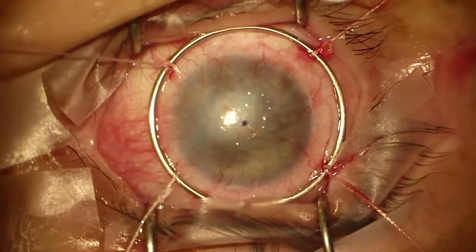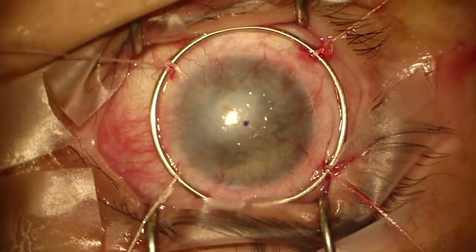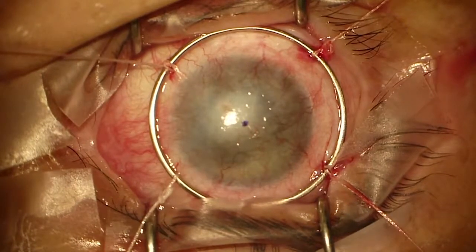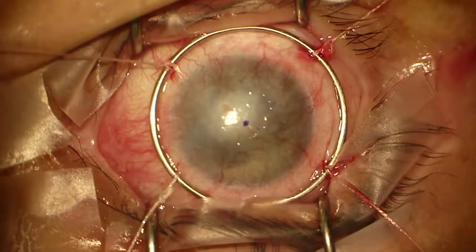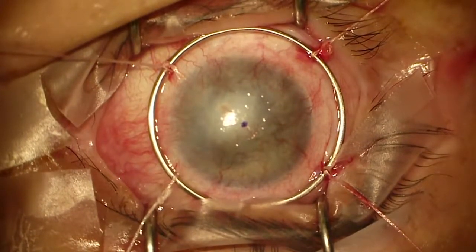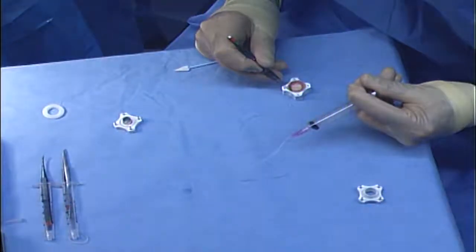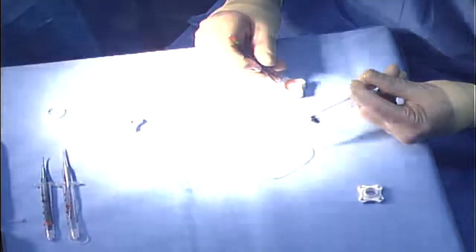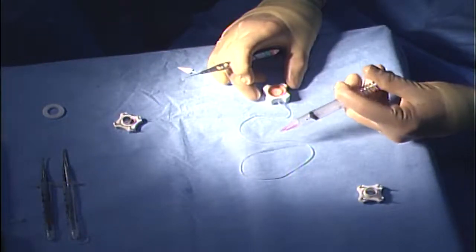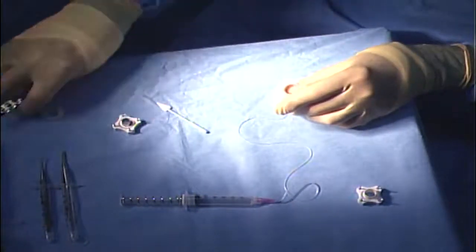This is a 49-year-old lady with bilateral alkali burns. This is actually the eye with the greater potential. And we're going to do a Boston keratoprosthesis, extracapsular cataract extraction, lens implant. So our plan now is we've measured 8.5 millimeters as the size of the donor carrier. And momentarily we will assemble the prosthesis prior to opening the eye.